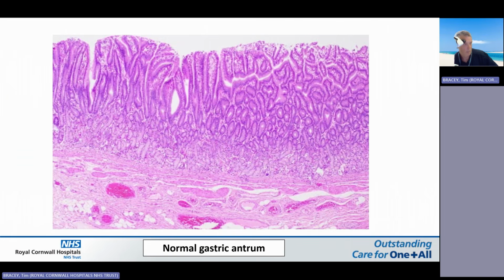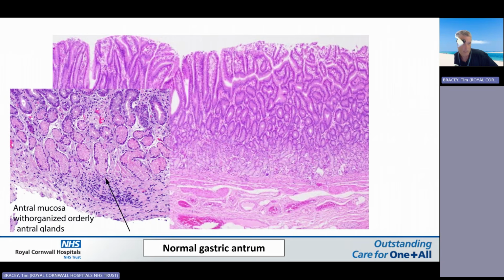The antrum, in contrast, the distal part of the stomach, and the pylorus looks the same under the microscope as well, is made up of long pits and very short glands. So these are the glands, and they're called pyloric glands. So even in the antrum, they're called pyloric glands, so they produce mucin. And you'll see these kinds of glands all over the GI tract.